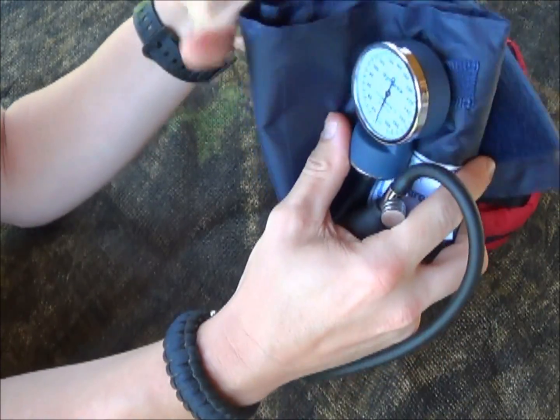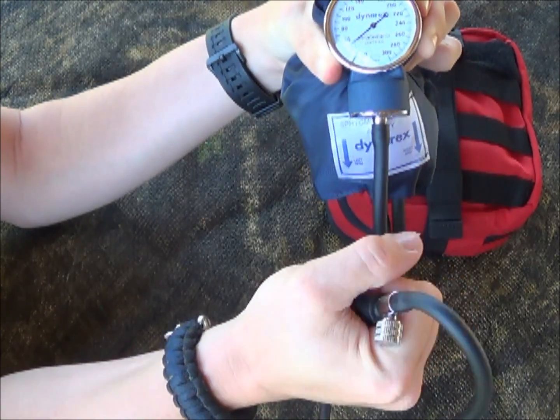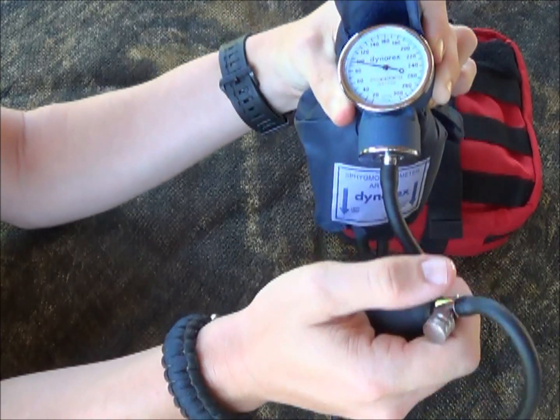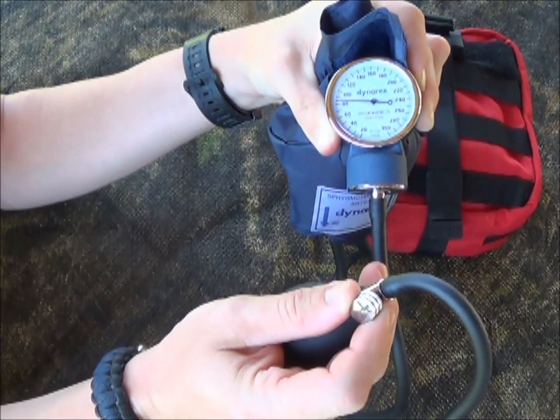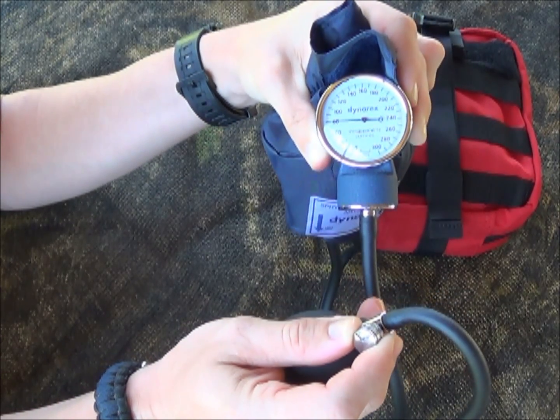As you pump it up, the gauge is going to go up in pressure. Then once we get to the point I'm going to talk about, you lower it down — undo this just a little bit. You don't have to open it wide open; just start to turn it and you can see the pressure gauge starts to fall.